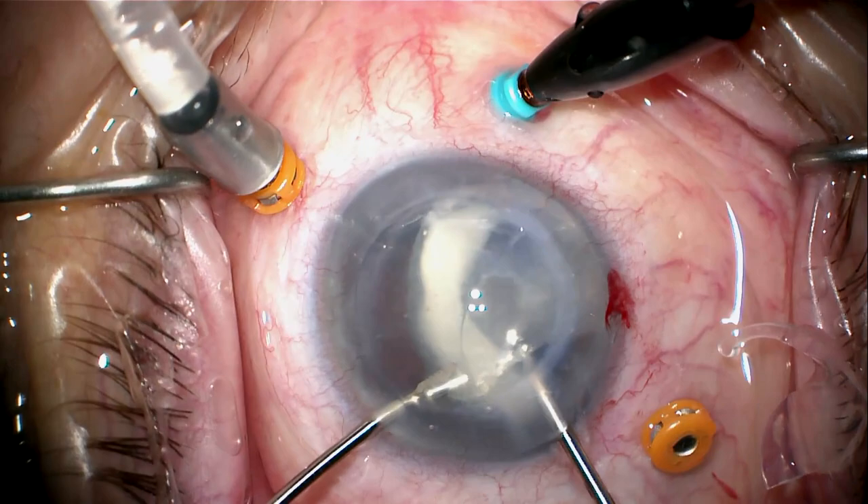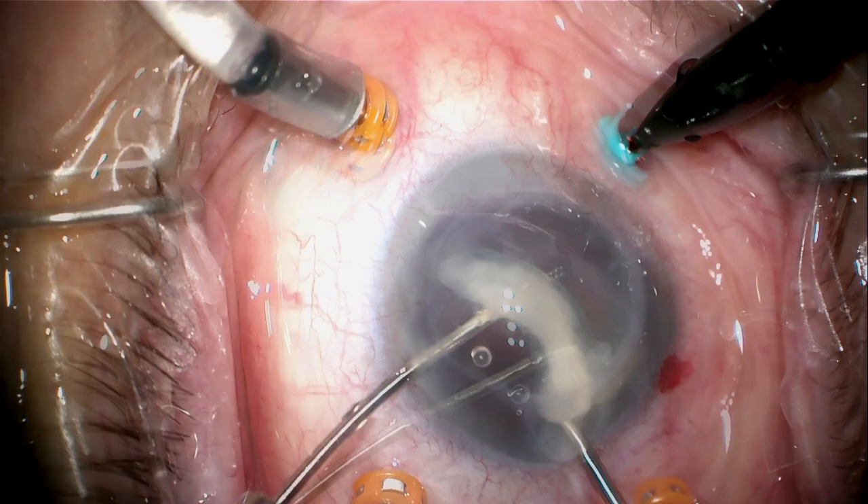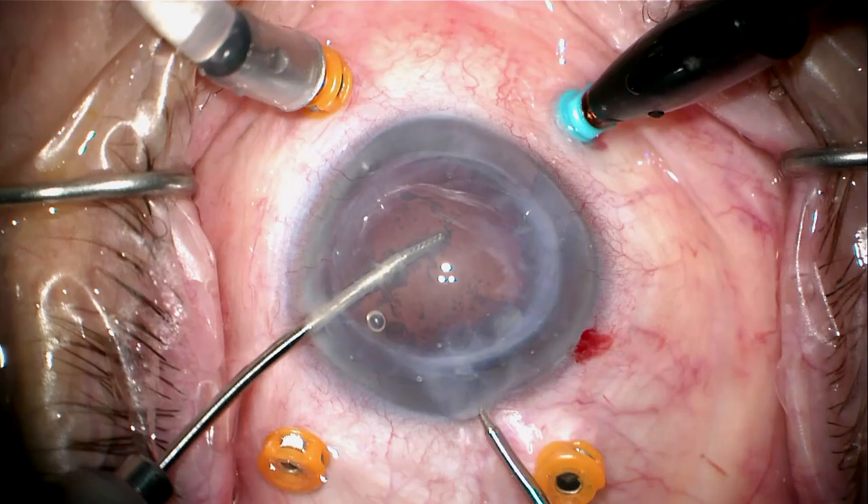Here's the other half of the lens. I'm going to grab this, manipulate it, and pull it out through the main incision — a 2.75 millimeter clear cornea incision. Now I can go ahead and burp out the rest of the Sumrins ring, which all comes out nicely.